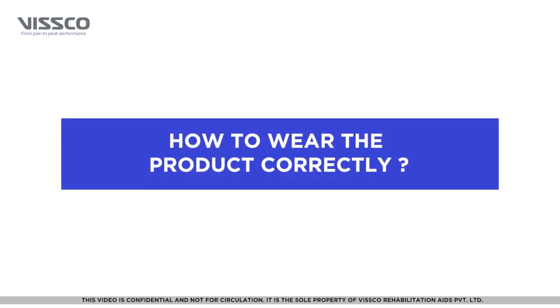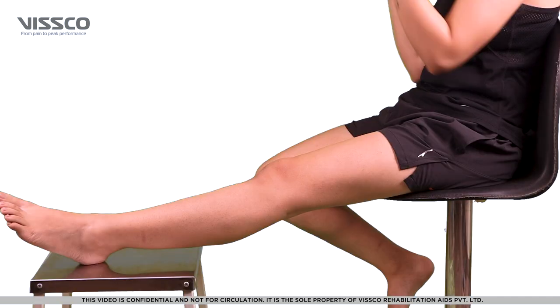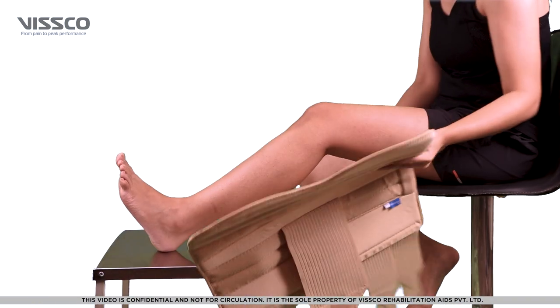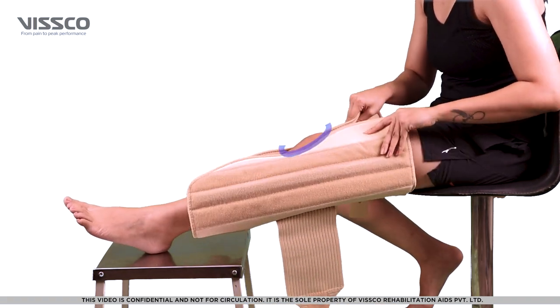Now that you have selected the right size, let's wear the product. Keep your legs straight — you can rest it over a low stool. Place the brace at the back of your knee, making sure the area over the patella is kept open.